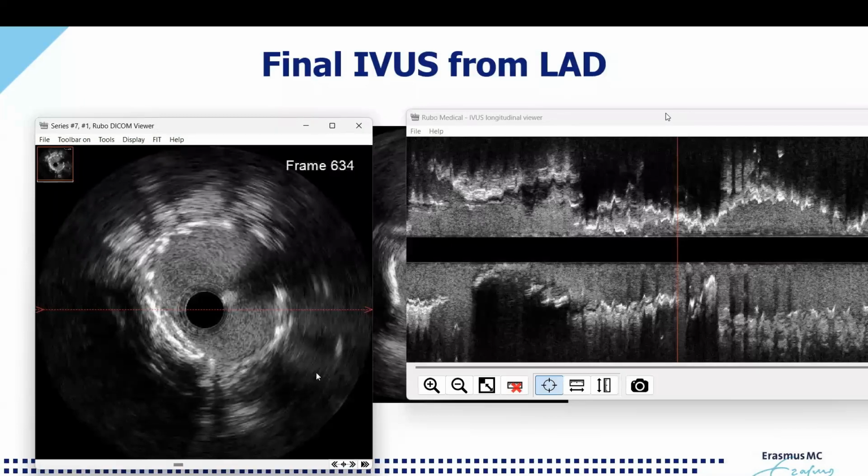You hardly ever take the complete distal strut, and then I have a very difficult time to believe that the crushed struts are better on the long term for the patient than these nicely aligned struts in the shape that they're supposed to be. Crossing the circumflex, I recently saw an example that indeed supports what you say now.